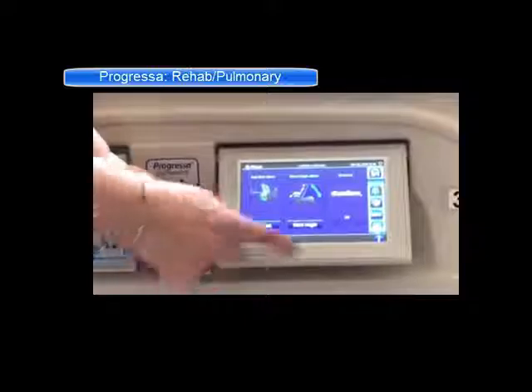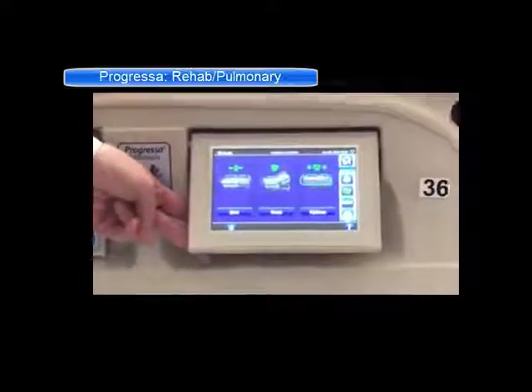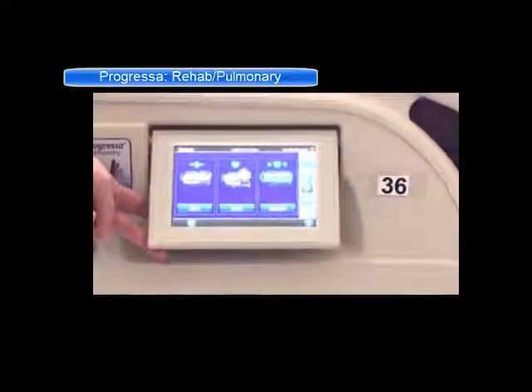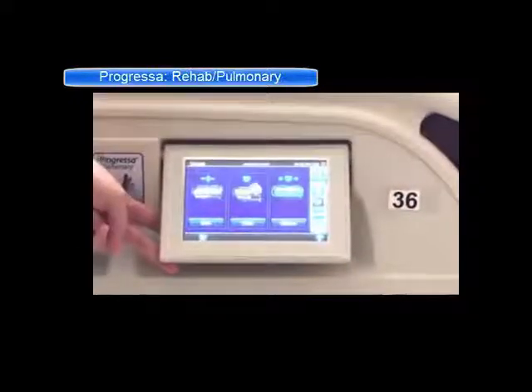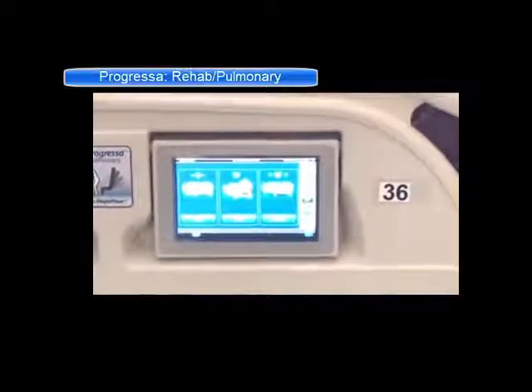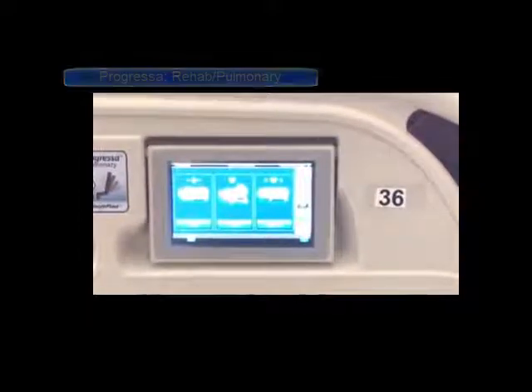You have a scale icon where you'll do your weights and zeroing — fairly self-explanatory. You can pull up the history and see what the previous weights have been, and you can see the history of any pulmonary therapies that have been used on the bed.